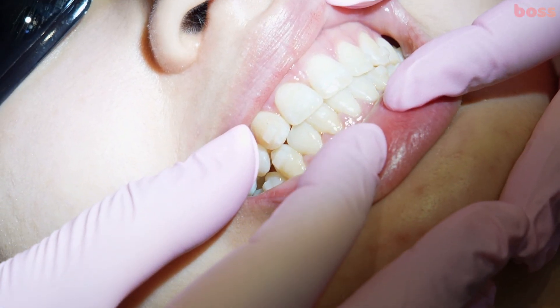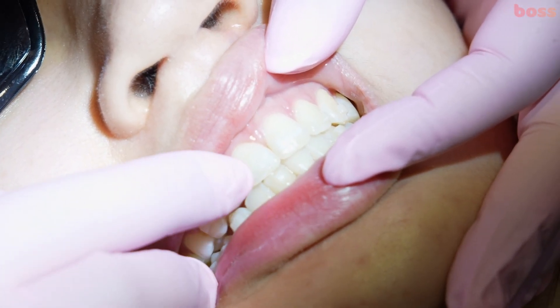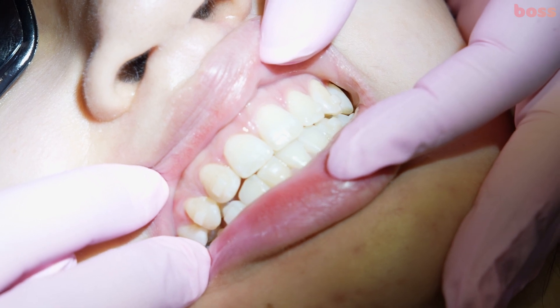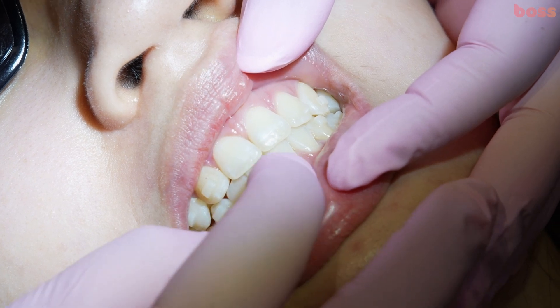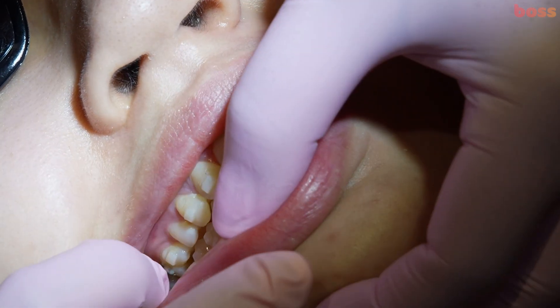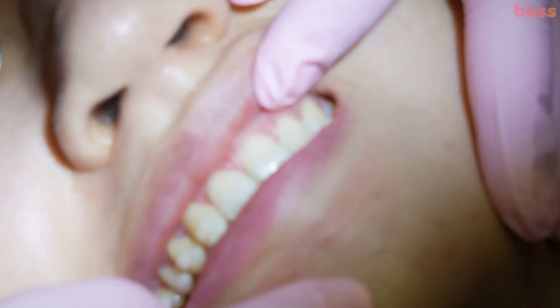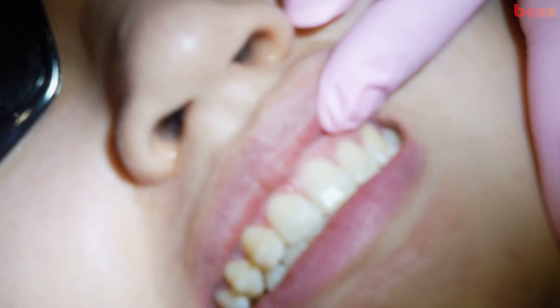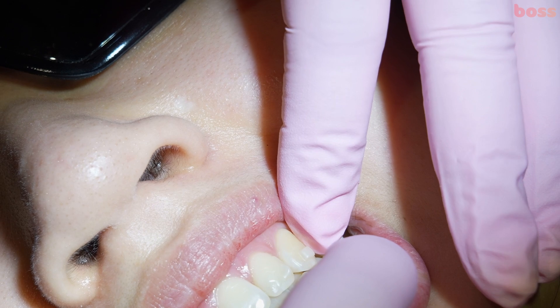Here we're seeing a patient where we've got a missing lateral incisor and this canine has been brought forward to mimic a lateral. The midlines are almost coincident and we've got a reasonable buccal occlusion. We mesialized the entire side, running a class 3 elastic on this side to help push the upper teeth over. On the other side we've got a class 2 molar relationship but class 1 canine.